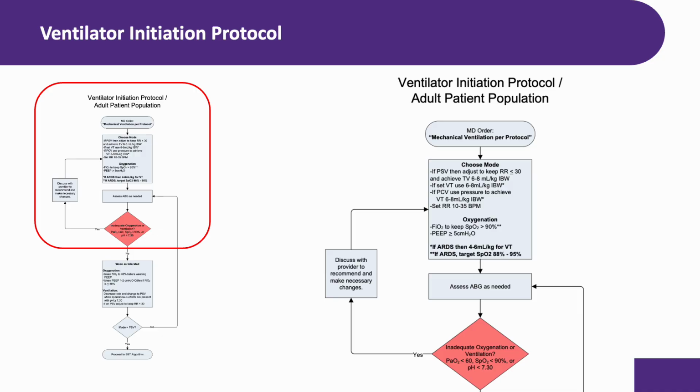And here's an important update I want to highlight. The pH threshold has been updated to 7.30 to reflect the updated guidelines and current literature. This is a change from what some of you may have been using previously, so make a mental note of that.